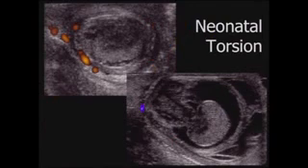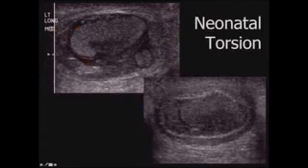Neonatal torsion is a little bit different. These are often pre-birth events. These testes are rarely viable, but we do get asked to image them. In this particular case here, this is a fairly acute torsion. This is actually the testis itself, and this is swelling within the walls of the scrotum.